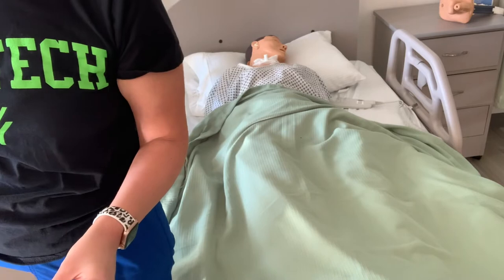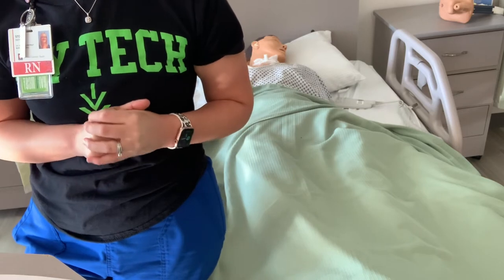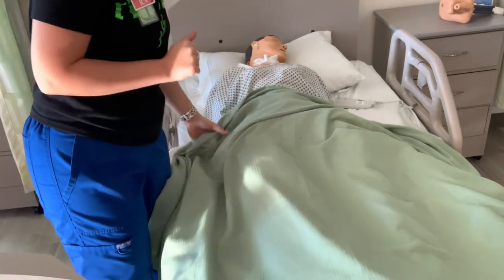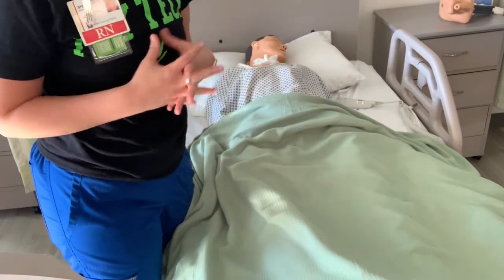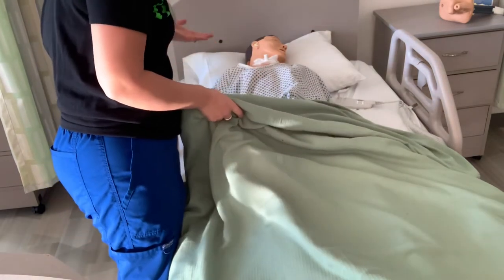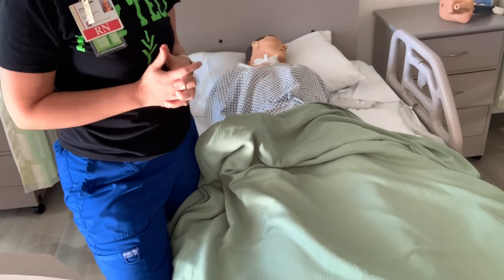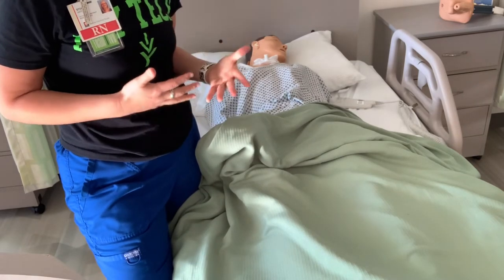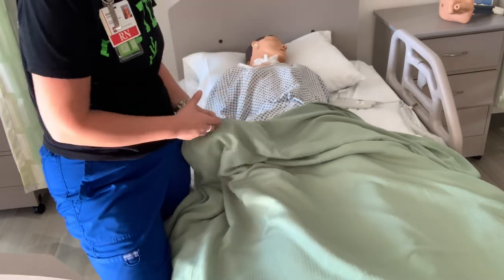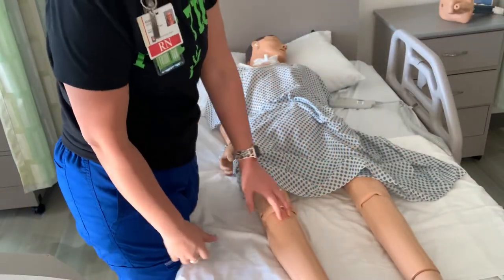Following your check-off sheet, first things first, we're going to prepare our patient. We're going to assist our patient into a dorsal recumbent position, drape with the sheet, and do not expose any area aside from the perineal area. That means we walk into the room, we do our initial steps: 'Hi, Mrs. Smith, I'm going to be doing a Foley catheter on you today. Do you mind if I get you ready?' Always asking for consent and telling our patient what we're going to do so that we aren't touching any private and sensitive areas without their consent.